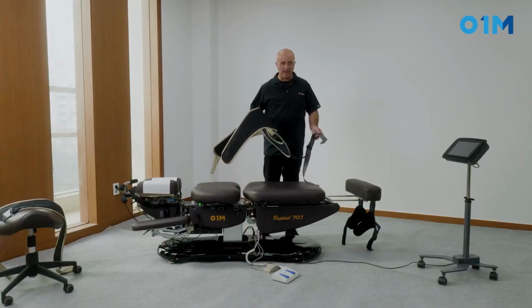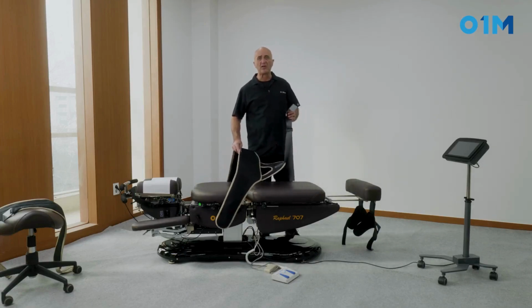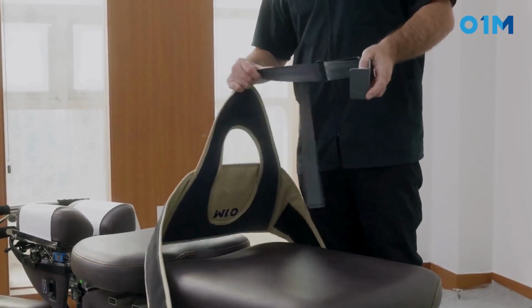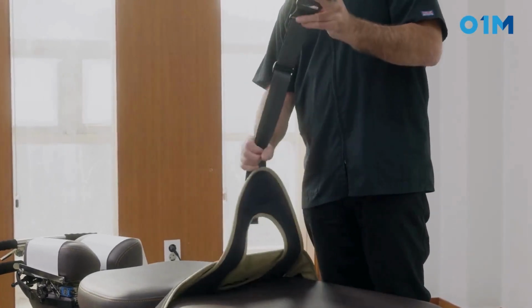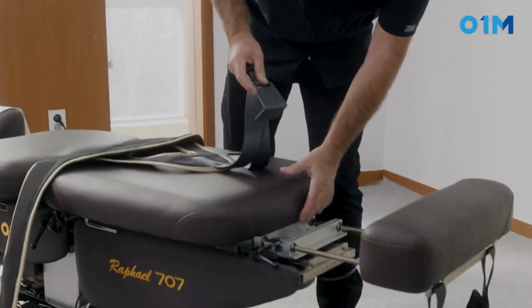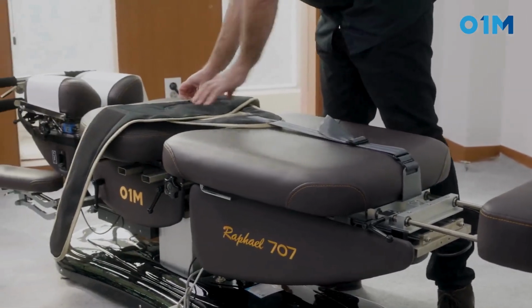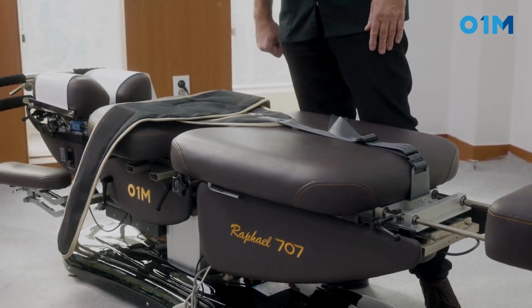This is a pelvic brace, the section that will go on the patient's pelvis. You have an L-shaped metal part, and you recognize the pelvic section by the fact that it can be stretched because people are different lengths. So I'm going to go just right here and hook it up, and the black part will go on the top, and the patient will lay on his back or on his stomach on that section.